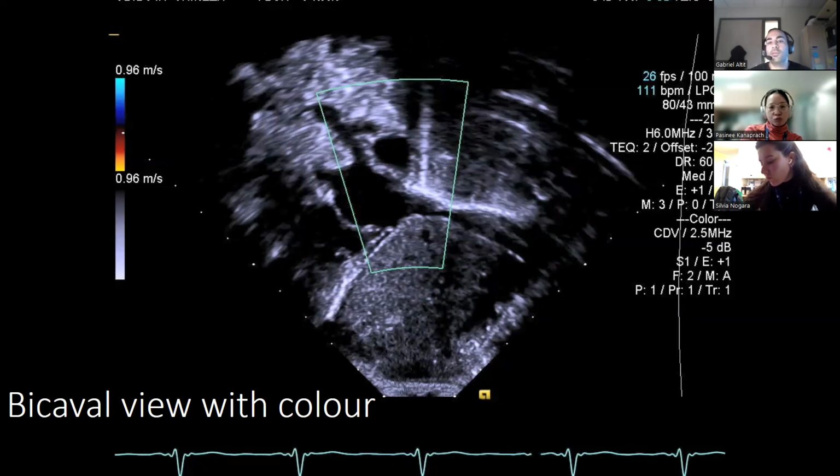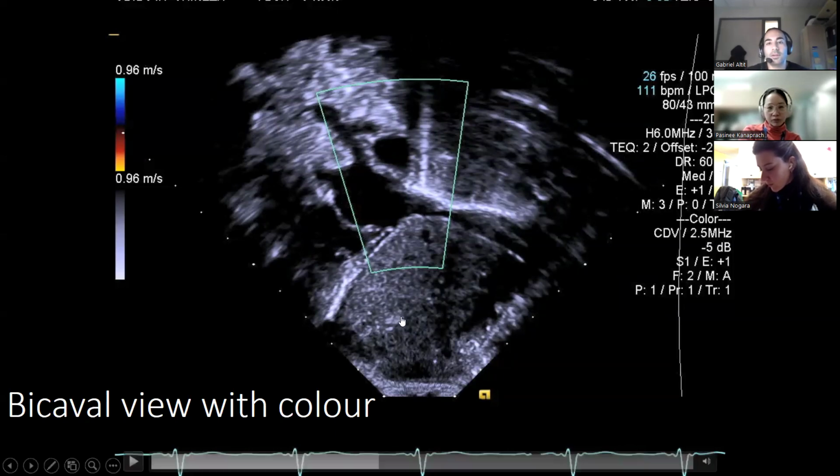Now, obviously, if you're in the emergency room and you see kids arriving with severe gastroenteritis using point of care ultrasound, it's much easier to look at the IVC under spontaneous breathing, and then it's a better assessment of volume status. But in babies, there are so many other things happening, like high PVR, RV hypertrophy, intubation, ventilation, even non-invasive ventilation, which sometimes can increase the afterload a bit. So all these things have to be taken into account when you're using these markers.